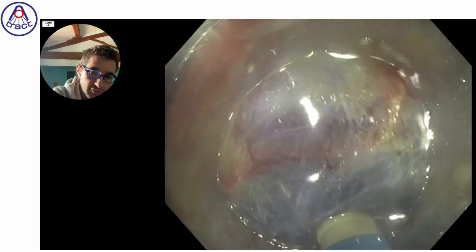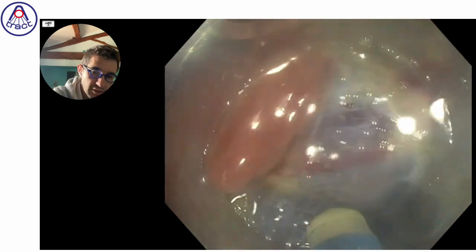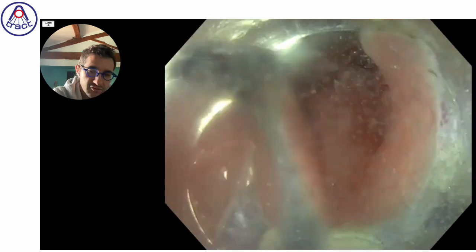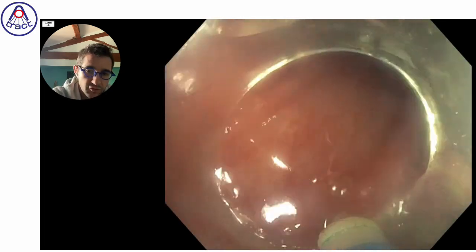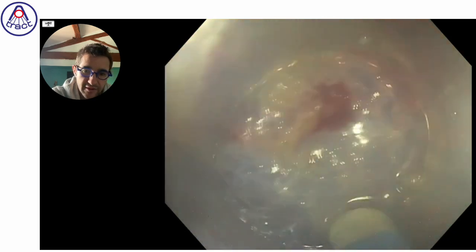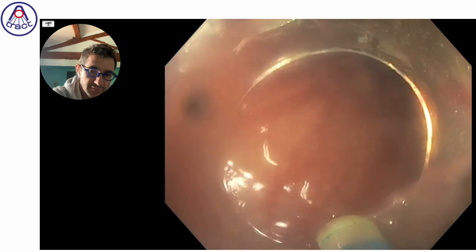Another point with the therapeutic colonoscope, not this one, but a therapeutic colonoscope with a flushing function that goes in the axis of the device, is that you don't have to move when there is a bleeding point. I mean, the flushing function is going exactly on your device, which makes the resection really easier to control the bleeding.